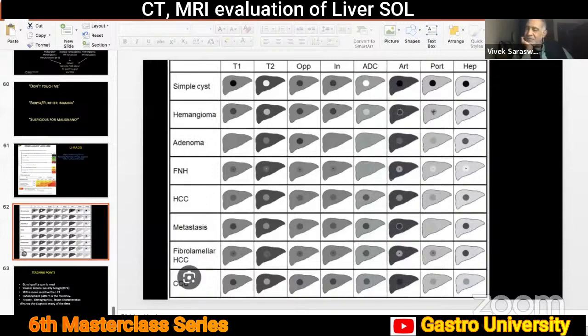Yeah. Go ahead. First question is, after doing an ultrasound, if it is a cystic or a solid lesion, when should we proceed with a CT or MRI? And if we should proceed, when should we do CT and when should we do MRI as the first investigation? All these are detailed radiological findings which are very good for a radiological audience. But from a clinical point of view, these are the questions which I would like. So quick answers, 1 minute answers from both Hira and you. Which lesion on ultrasound we can stop at ultrasound, and which should proceed with CT and MRI, and if yes, whether CT or whether MRI as the first investigation.